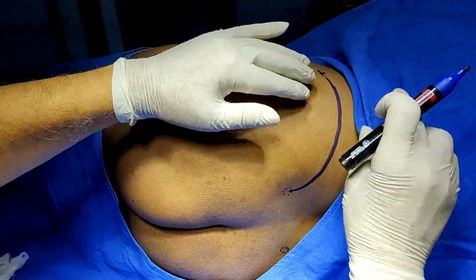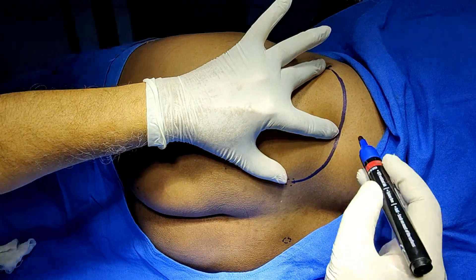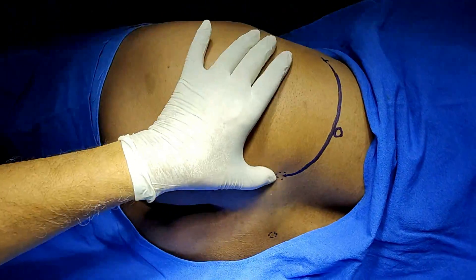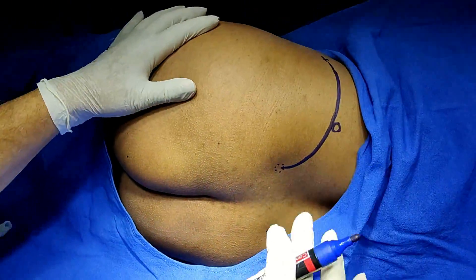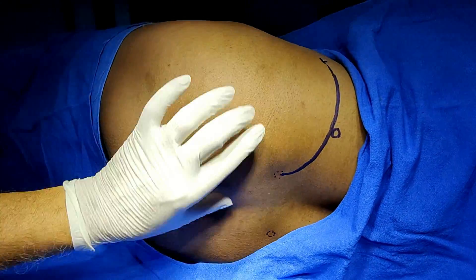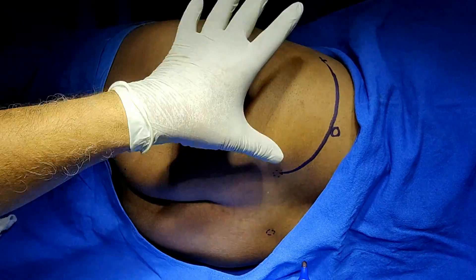This is the iliac crest. Using my technique, I'll select the top of the parabola and take the midpoint here. From here I will approach the lumbar plexus. Now, from the posterior iliac spine — just palpate it and confirm — this is the dimple here.